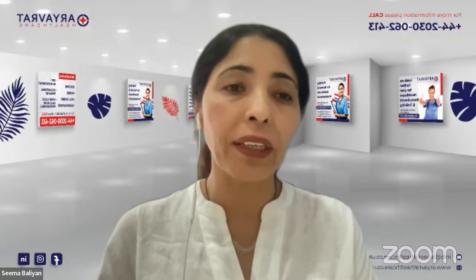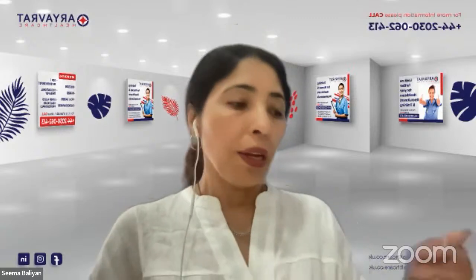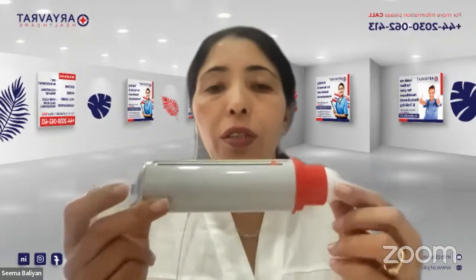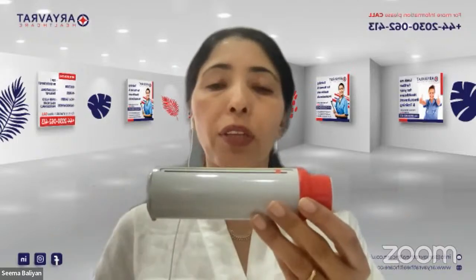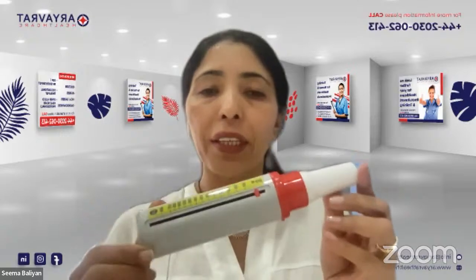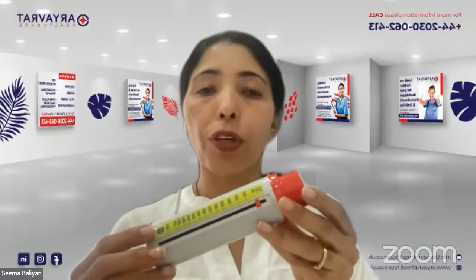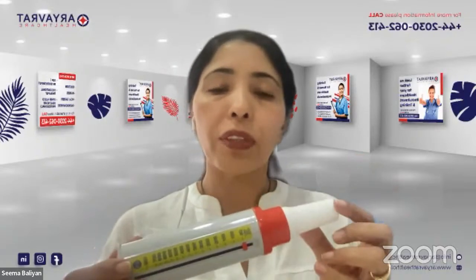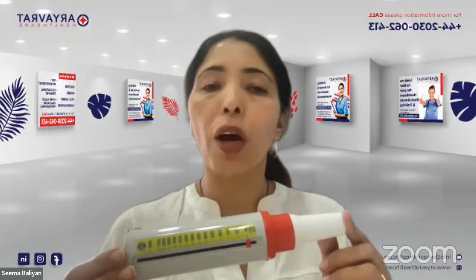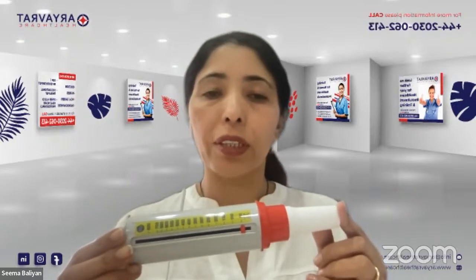As we have already said, the first thing that we are going to be doing is the peak flow. Now, I'm going to be showing you the peak flow. So this is what a peak flow looks like. I'm going to be telling the patient that I'm here today to teach you about the peak flow, and this is how a peak flow looks like. Have you ever seen a peak flow before or used one before? Whether the patient says yes or no does not matter, because you are going to be showing the patient and telling the patient what a peak flow is.